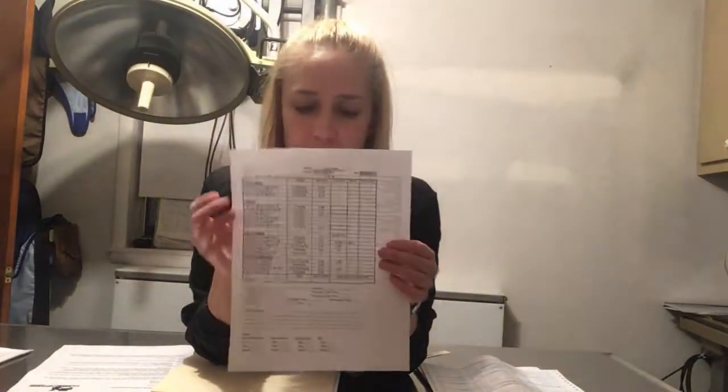So for during the procedure, we do keep track of the anesthesia on an anesthesia monitoring chart. We have ours on the back of our procedure sheet. Our procedure sheet is where we'll fill out what medications: pre-medication, induction, pain medicine, all the main ones that we normally use are on here.